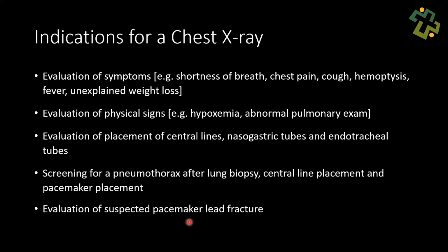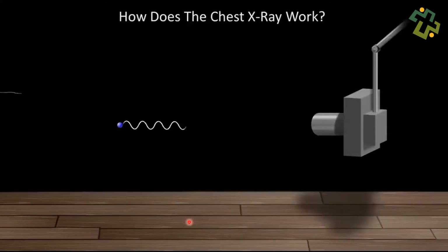Now, there are a few indications not listed here. For example, routine chest X-rays before surgery. In the overwhelming majority of patients, these are of no benefit and should actually be avoided. Also inappropriate are routine screening chest X-rays for lung cancer in smokers. Although these may be of benefit in screening, probably chest CT is a better option, but that's a discussion for another day.